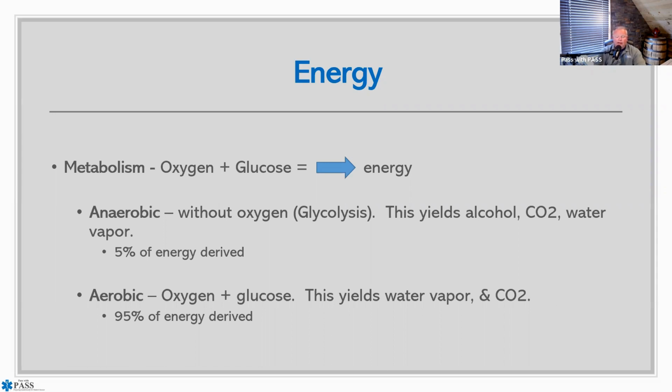So anytime we are talking about end-tidal CO2 or capnography, we have to understand that that is a byproduct of metabolism. We have metabolism, we have all of the breakdown parts from the metabolism taking place, and now we have what those byproducts are, one of which, and the important thing to us, is end-tidal CO2.